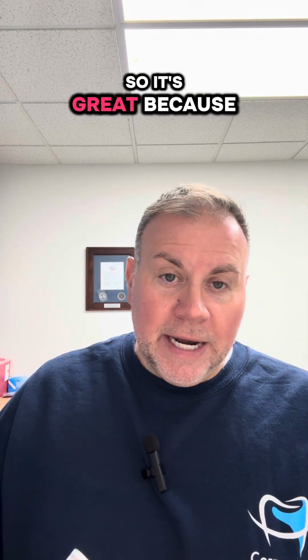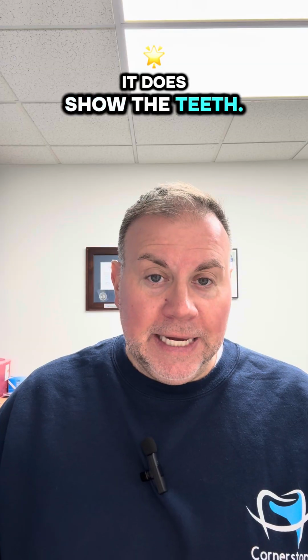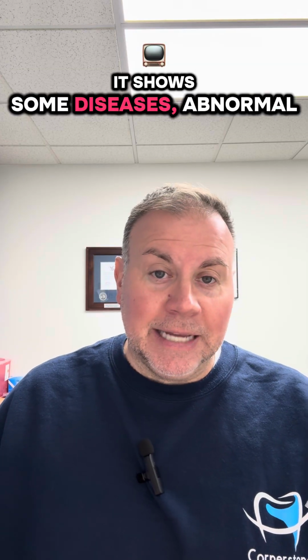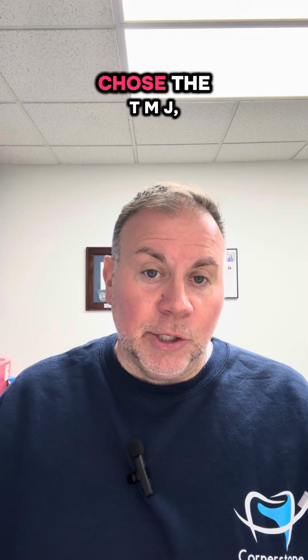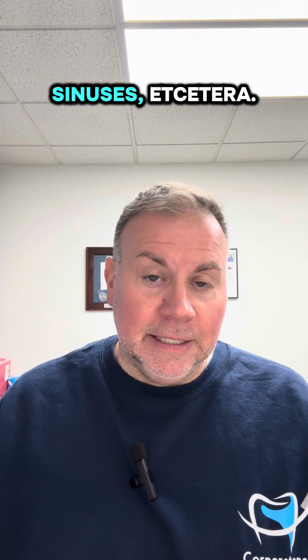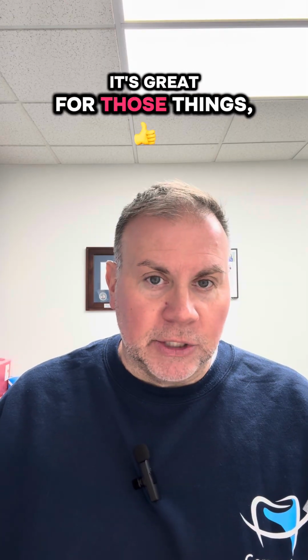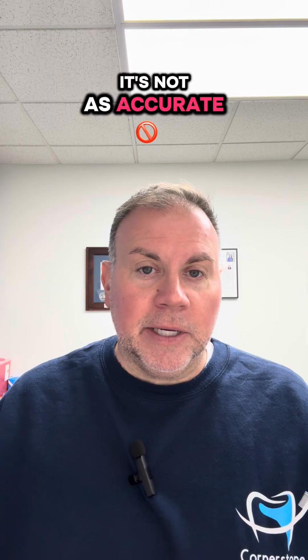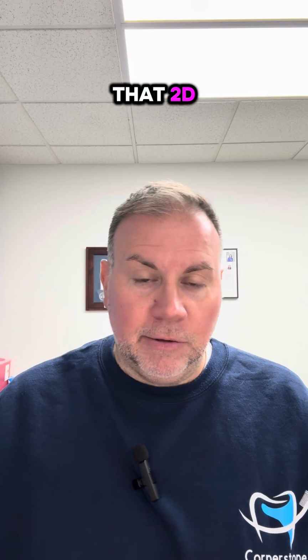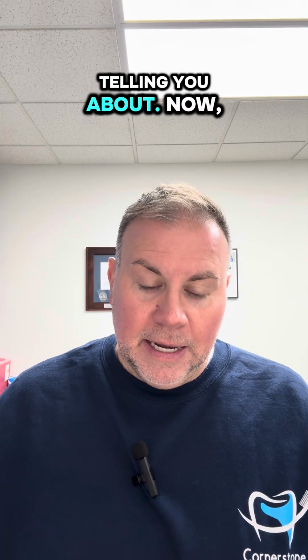It's great because it does show the teeth, it shows some diseases, abnormalities, and of course, it shows us those impacted teeth, those wisdom teeth. It shows the TMJ, sinuses, etc. It's great for those things. But when it comes to diagnosing, it's not as accurate because of that overlap and that 2D, 3D that I was telling you about.